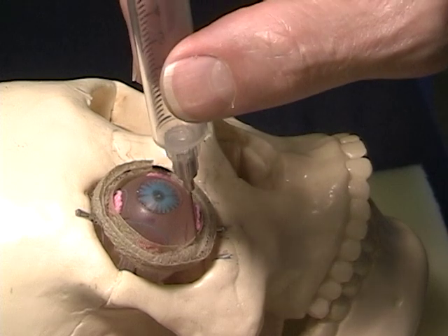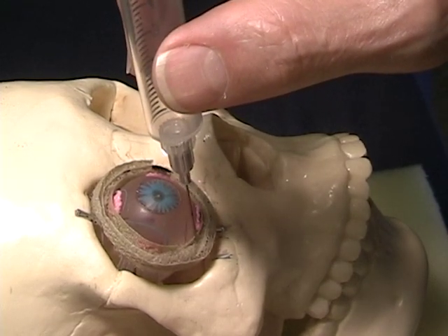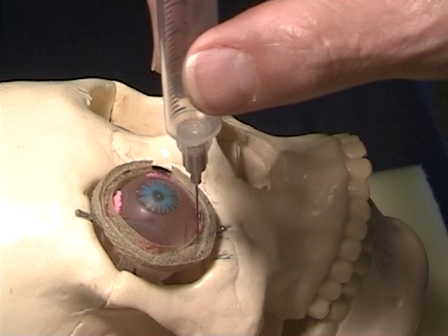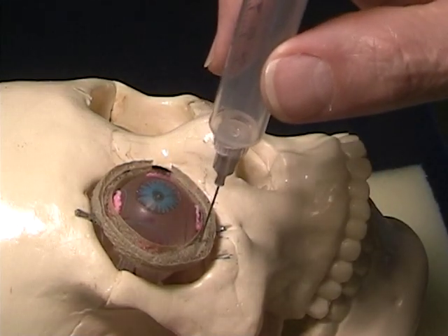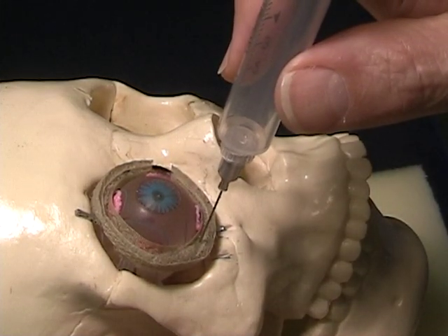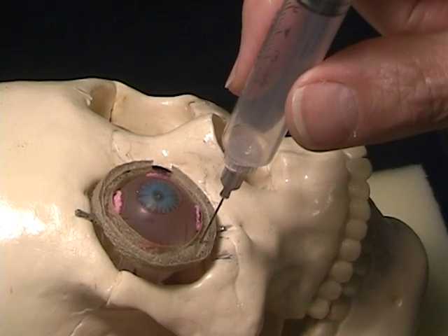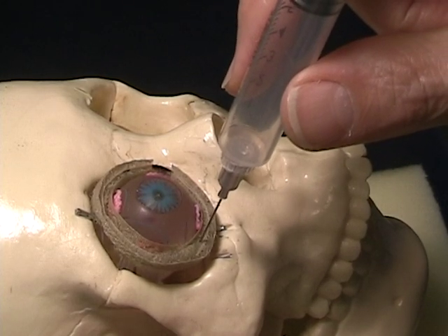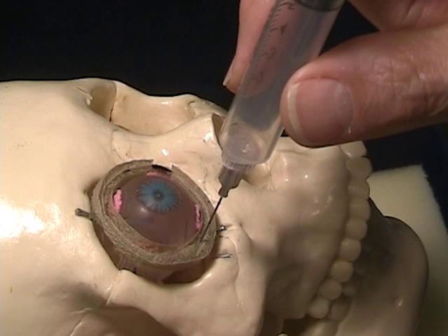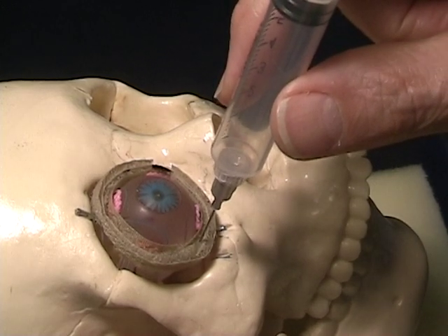We'll insert the needle about 2 millimeters, or the length of the bevel. Once we've inserted it that distance, we will bring it to about a 90-degree angle to the face and reassess our landmarks, making sure we're lateral to the limbic line. At that point, we will insert the needle approximately 12.5 millimeters.